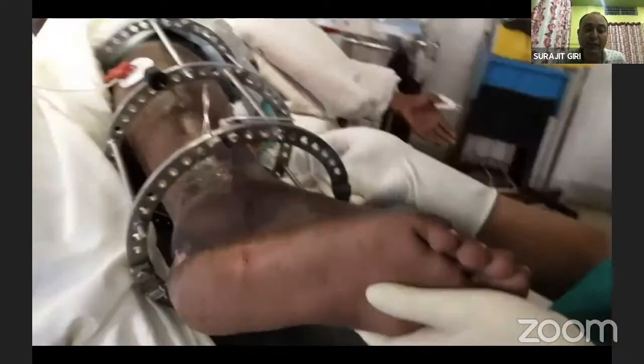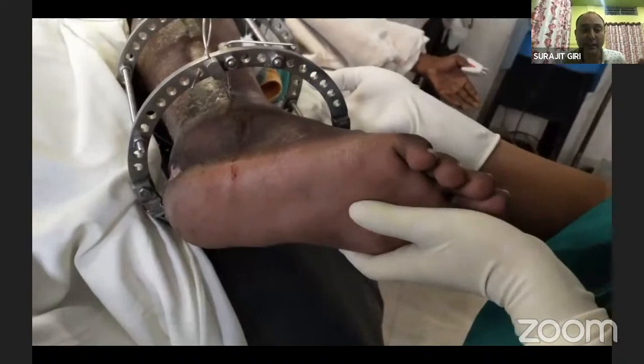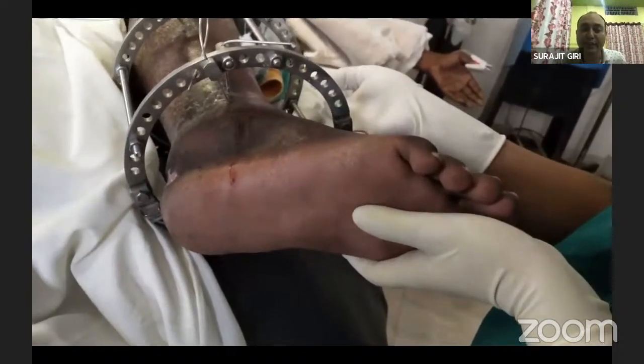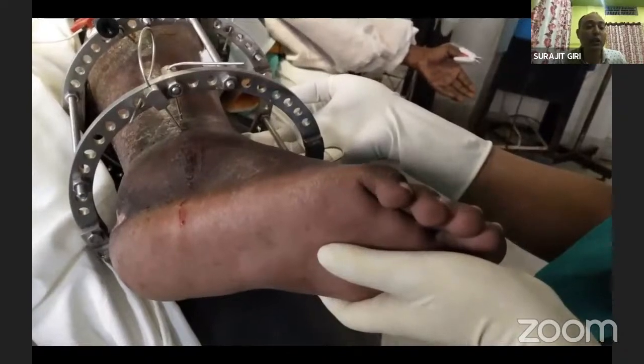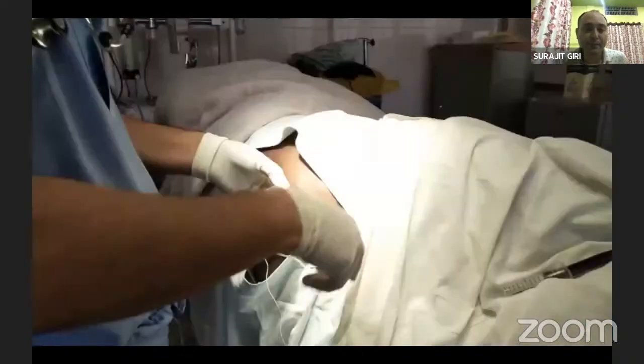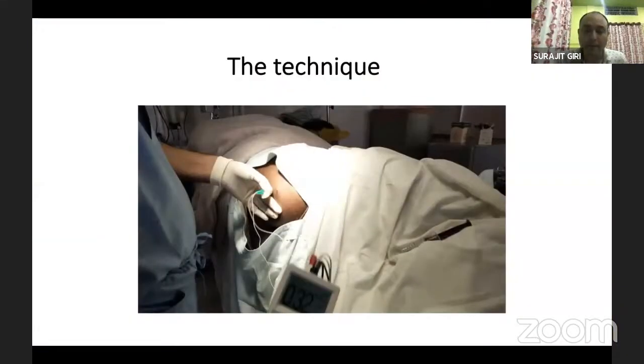In our sciatic nerve block, it is a very thick nerve, so you go for around 0.3. If I am getting the twitches at 0.3, that will be the end motor response, and then we inject the local anesthetics. So this is the threshold point, 0.32, in all patients.